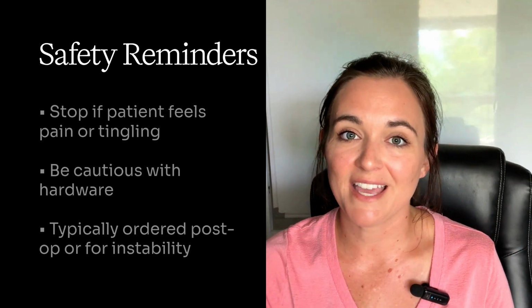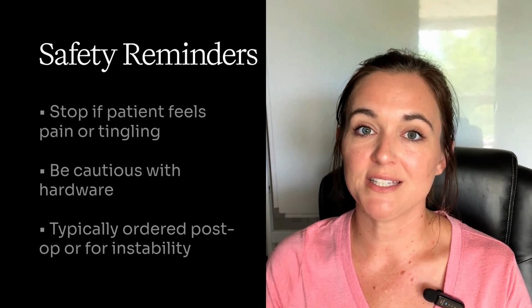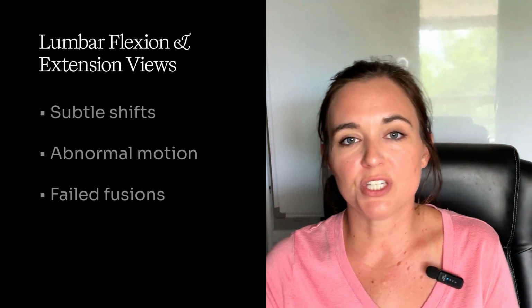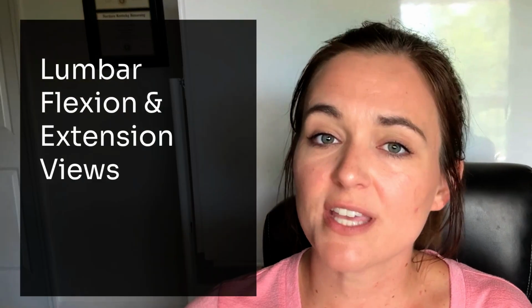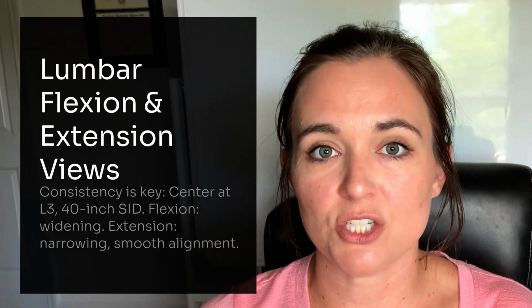All right, let's recap your lumbar motion views. They're typically ordered post-op or when instability is suspected. You're looking for subtle shifts, abnormal motion, and failed fusions. Your setup stays consistent. L3 centered, 40-inch SID, and L1-S1 collimation.